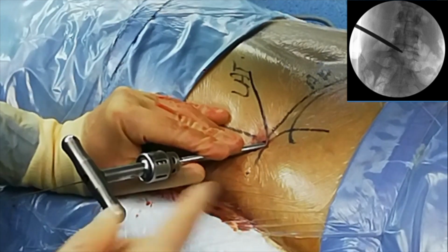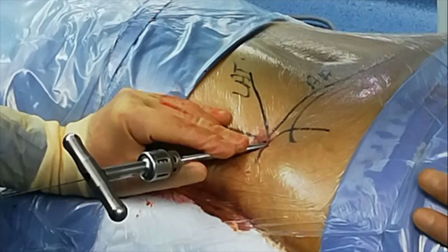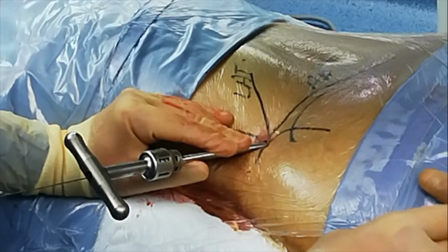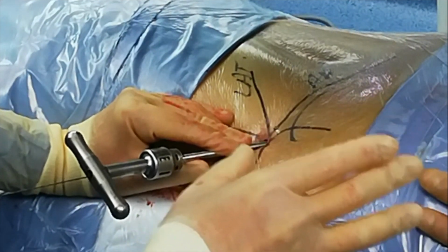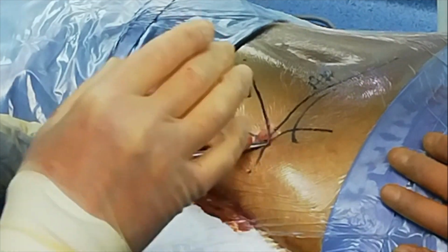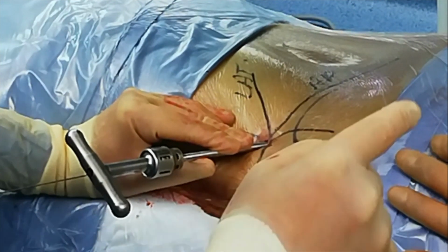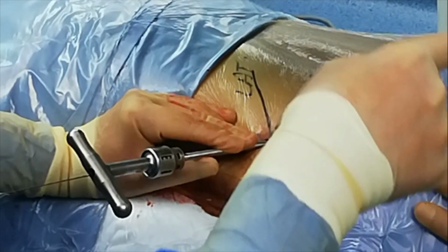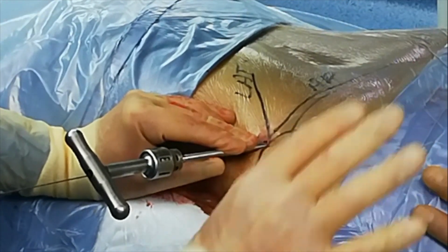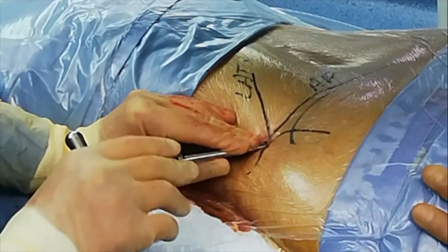And every time I ream, my very good and experienced senior scrub nurse Malik, thank you Malik, is putting his hand on the patient's left leg, just in case I touch or irritate that exiting nerve root, the leg will jump and he will feel it and we'll probably see it. This is extremely rare, but it's a precaution you should take. He also stabilizes the patient with his right hand, because as I ream, I will push the whole patient towards the other side. His right hand stops me from pushing too much, keeping the patient in position.